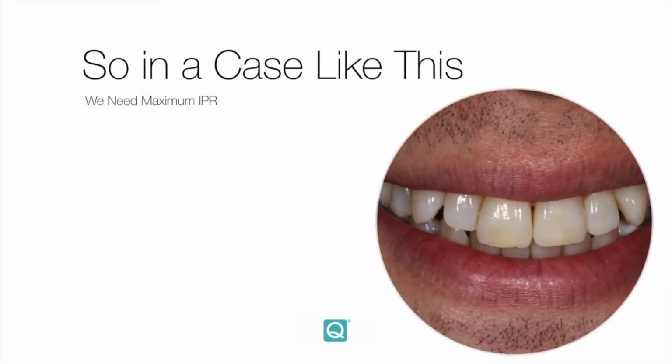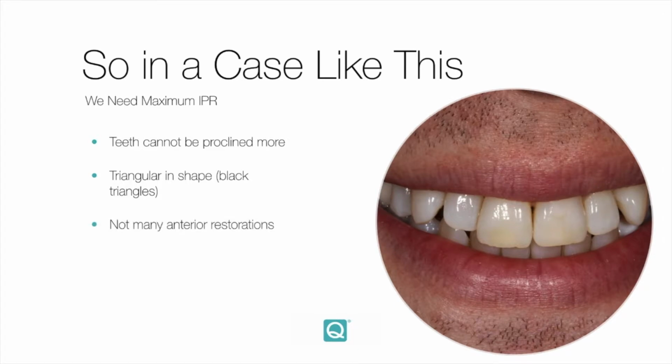So in a case like this, because we cannot rely on any arch expansion, we do need to rely more heavily on IPR. And this is because the teeth can't be proclined any more than they are. They are triangular in shape, and because we have this black triangle in the middle and between the centrals and the laterals as well, we can improve the tooth shape and eliminate the black triangles with IPR. So that's a good indication for doing IPR. Unfortunately, we don't have any anterior restoration, so anything that we do reduce will be on natural tooth surface. And the height-width ratio of the front two teeth can be improved.